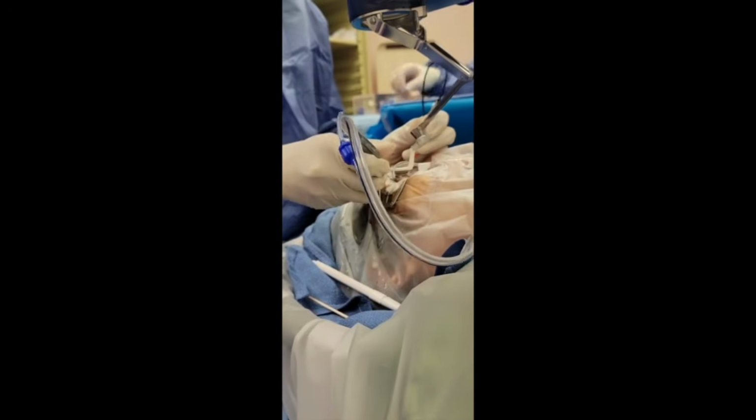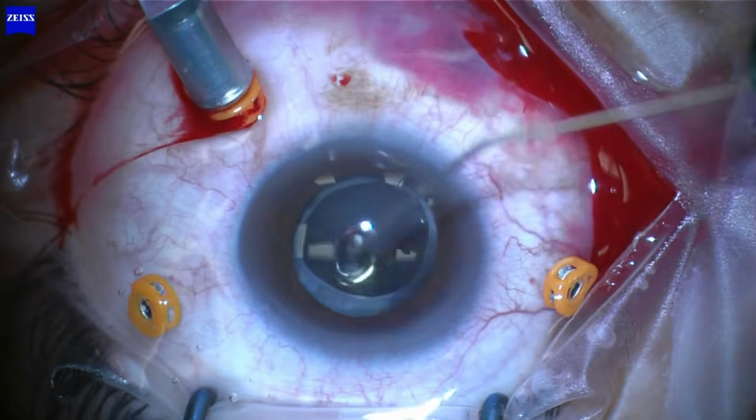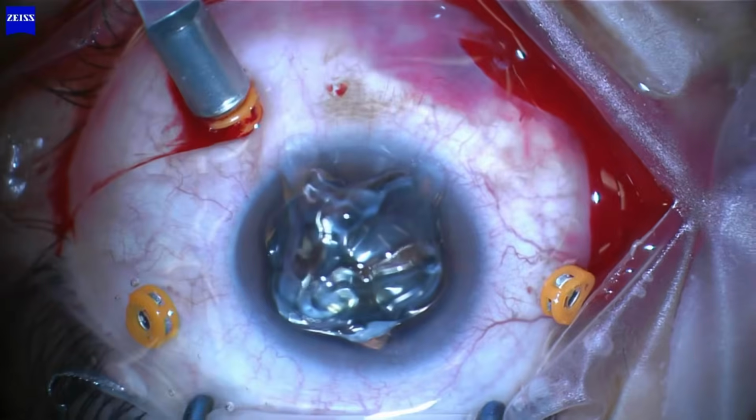Here is a side view of a surgeon operating using this lens system. We now switch to show you the microscope view utilizing this lens. Again, ProVisc is applied to allow the lens to be coupled to the corneal surface. The microscope is lowered to dock the lens in place. It is easy to tell when the lens has docked due to a change in the viscoelastic meniscus. Let us again see in slow motion the moment at which the lens makes contact. The lens system can now be used in standard fashion to carry out retinal surgery using the operating microscope foot pedal to control magnification and movement.